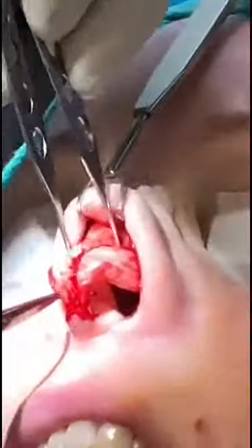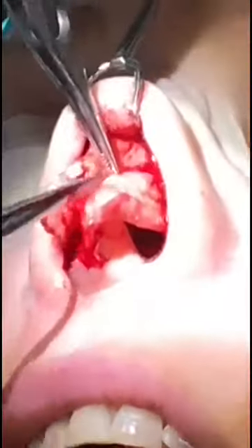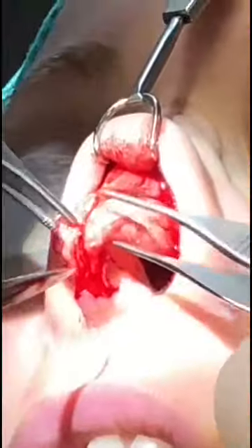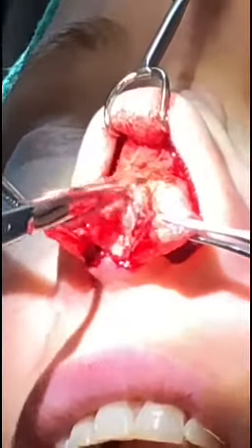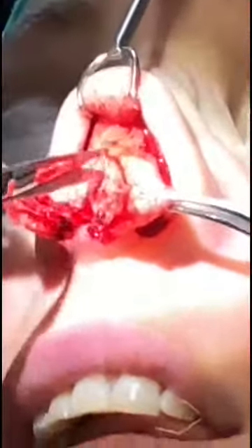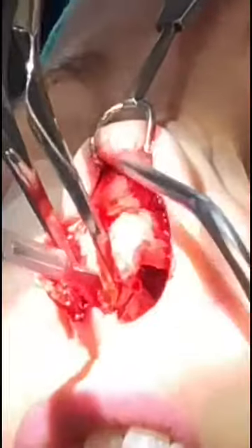So we can see the structure of the tip here. The tip itself is not really bad — you can see the cartilage bends a little bit, and we're going to improve that some. It's a little bit wide here, and we'll bring that down. But the crookedness is her main thing. So we're going to start by coming down onto the septum, which is kind of the base of the nose. If the septum is crooked, you're never going to be able to get the nose straight. We mostly want her breathing to be good after the rhinoplasty.